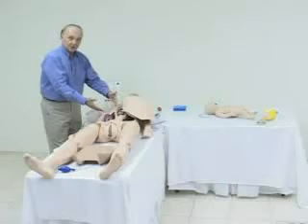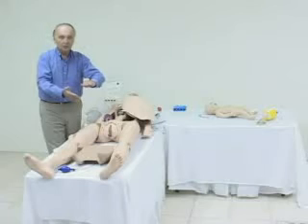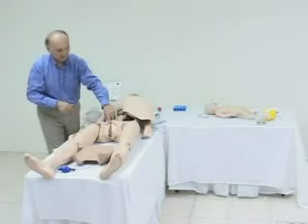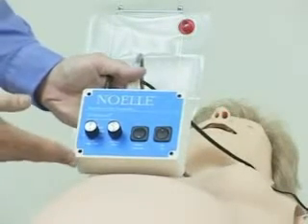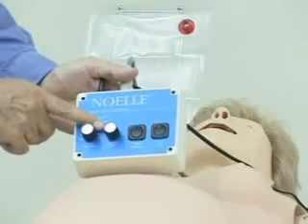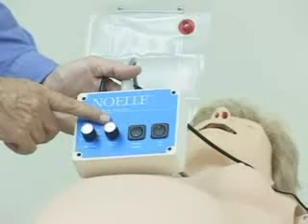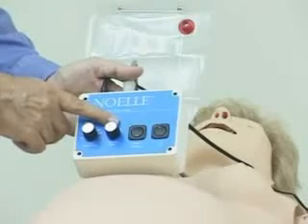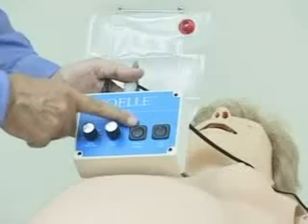The fetus during this birthing process will start in ROA, and as it progresses down the birth canal, it will move toward a nose-down position. Then it will rotate once again to present its shoulder. Noelle is powered by this device where the fetal heart rate is adjustable from 60 to 140, all the way up to 200 beats per minute in increments of 20 beats. There are four different delivery speeds — the fastest being about two minutes and the slowest being 15 to 20 minutes. At any time during the process, the instructor may pause to make a point and then resume the process.